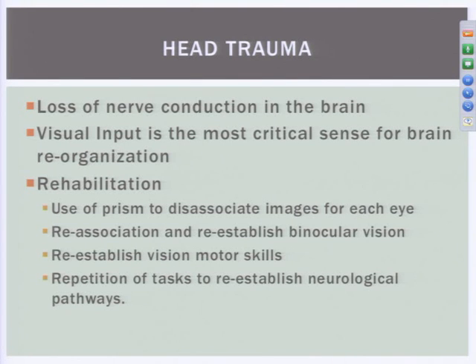So we use a number of prisms. First, we use the prism to show frank double vision. People who have been brain injured often have mild double vision that comes and goes. It's because they have a natural tendency for their eyes to drift apart, and because the brain's been scrambled, they can't control their visual motor function like they did before they were injured, and so they see intermittent double vision. And frankly, even if it's not double, the world is confused, and they're not really sure where that chair is, whether it's a foot away or 10 feet away.